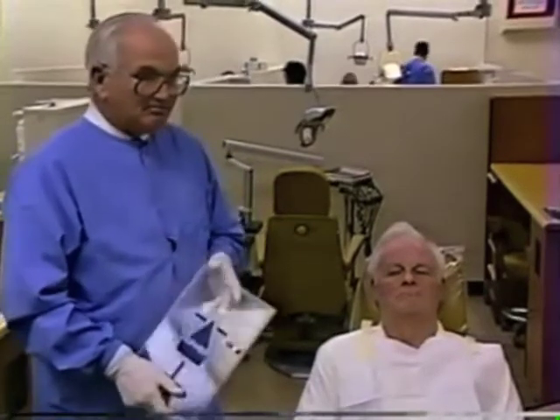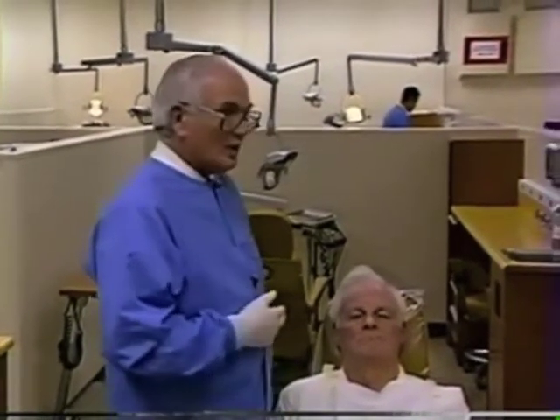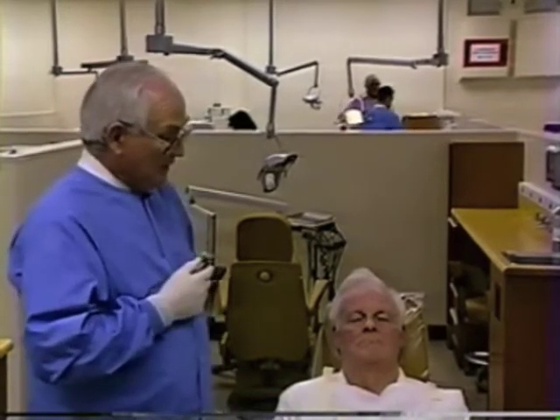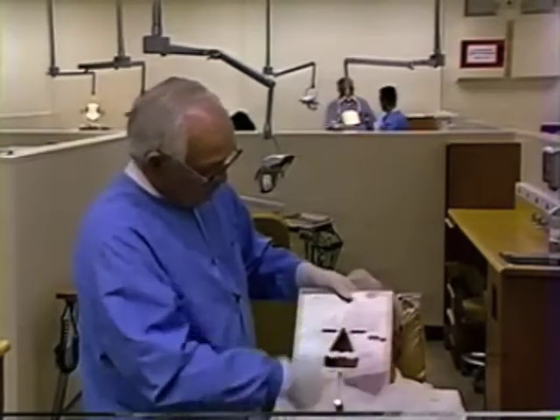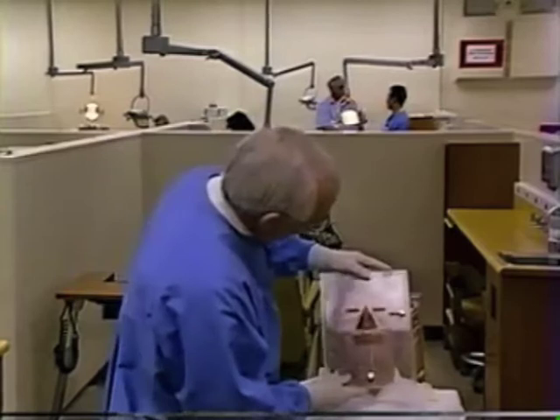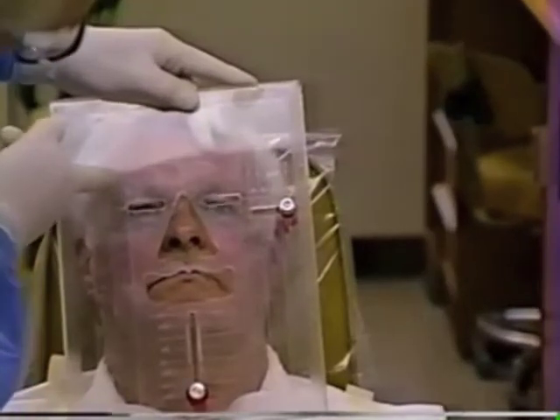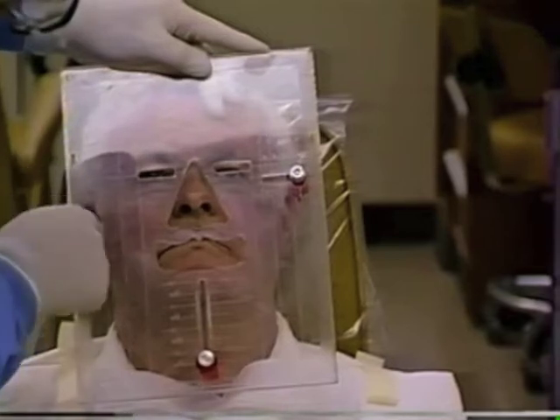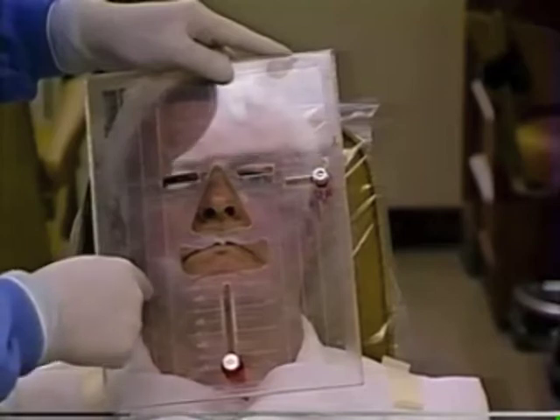In addition, faces can be categorized into square, tapering, and ovoid, and combinations thereof. This gadget has parallel lines running vertically that help us determine face shape when placed on the patient's face. From the hairline down, this face is virtually straight with just a little bit of taper — so what we have here is a square tapering face.